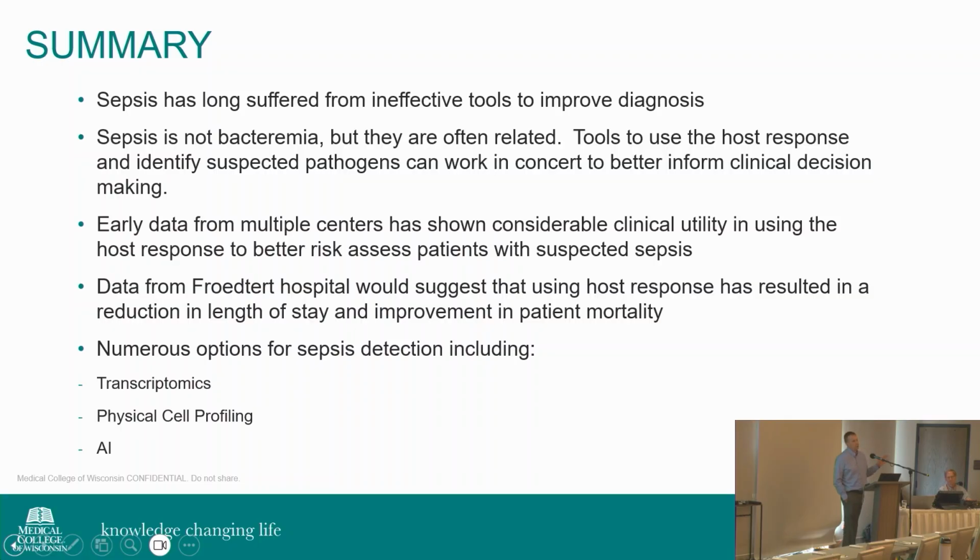And Tim, you point out a really important characteristic that folks need to look at when evaluating these tests. So the Intellecept for us is a fairly big instrument. You're talking about an instrument that's going to take up about this much bench space, and you have an initial 8-minute step on the instrument, then you have to take a component off and put it into a reader. You really need a laboratorian to run that, which means that if you are trying to support a location that may not have 24-hour laboratory service, maybe a lower volume, that test may not be as good a fit.